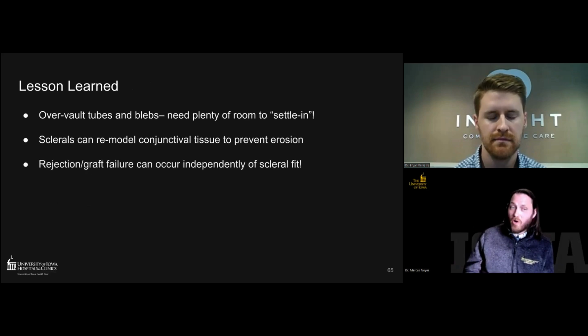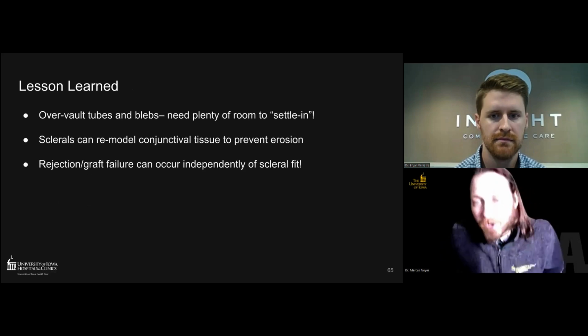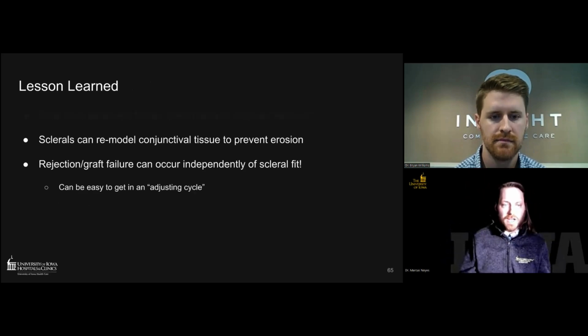And then always you have to remember, you can have graft failure independently of your scleral fit. You have to treat the eye and try and match what's going on there rather than just trying to get a perfect fit every time.